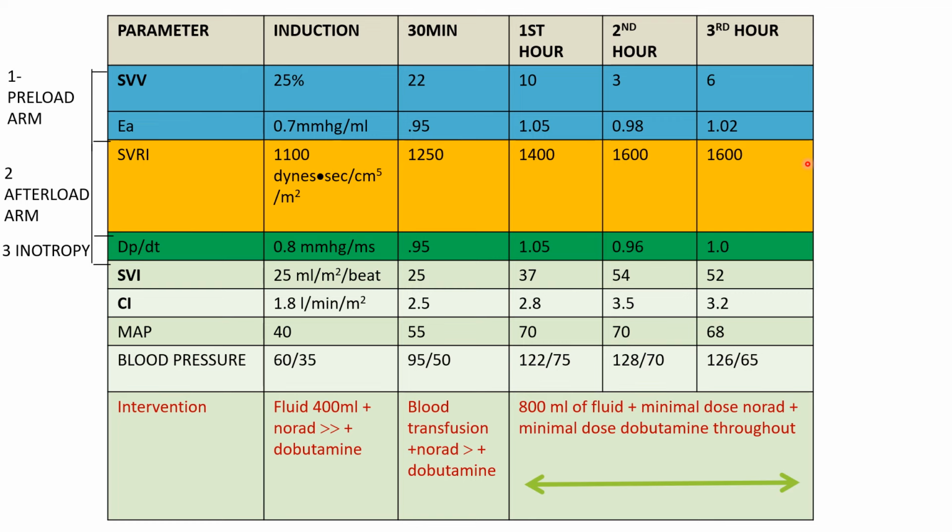Now, a disclaimer: were we not aware of what can happen with such high volumes of fluid? We were aware of that. We had backup ready. If the patient goes into pulmonary edema, what has to be done? So this takes some time to understand and interpret. It is an ever-learning curve. So don't go home and use this straight away on your patients. Take some time to understand it. Use it on some ASA 1 or ASA 2 patients to understand how this works, and only then start using it in higher-risk cases.